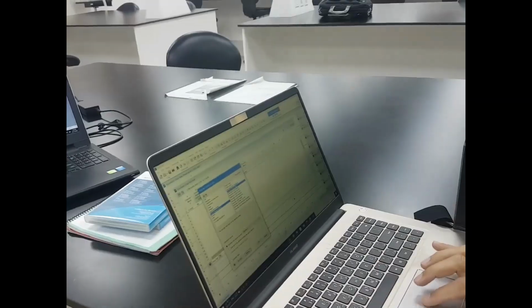All right. Now you see you have got HRV here at top. So how we can do HRV analysis is just an introduction, so you will have a little idea. I am just selecting a very short segment just for demonstration. It should be a 5-minute segment.